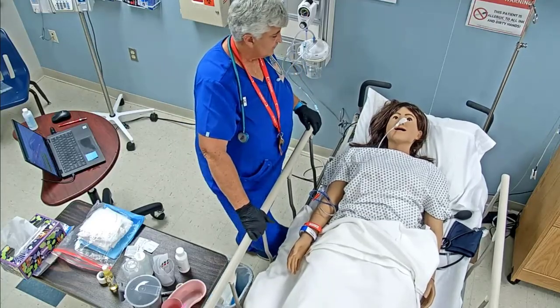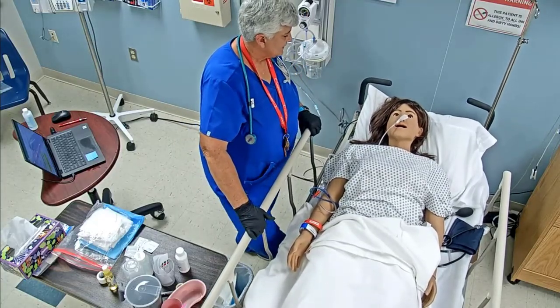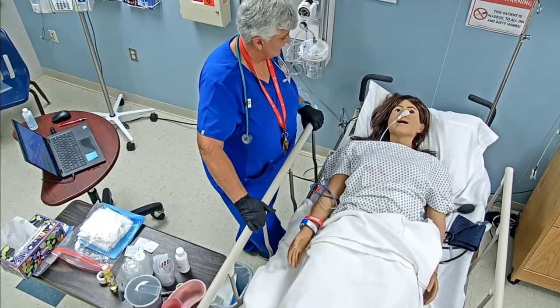Here. Let's use the right one. Usually it's not quite so cranky here.